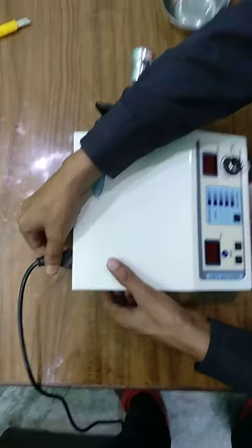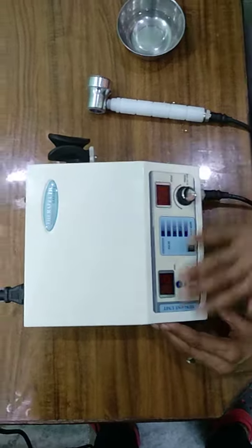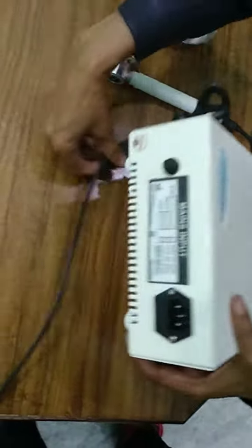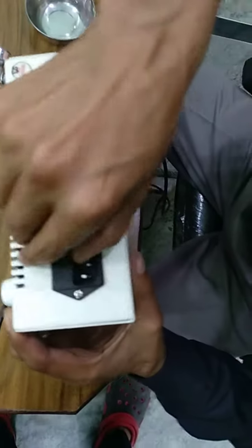Stop. If there is nothing happening when you switch on, then you have to replace the fuse. The fuse is located on the back side, under the power socket.